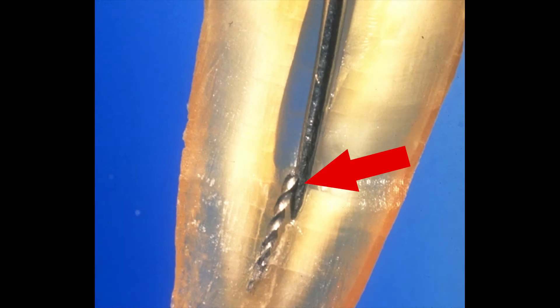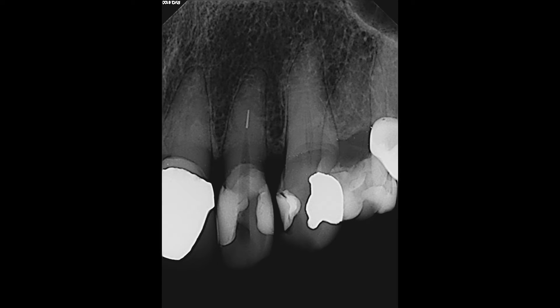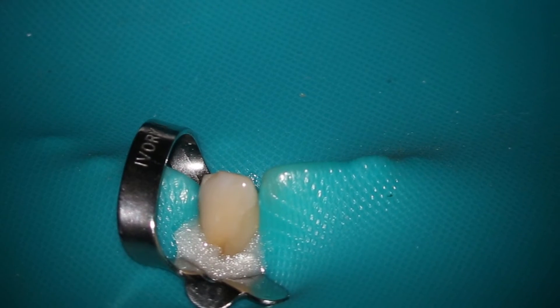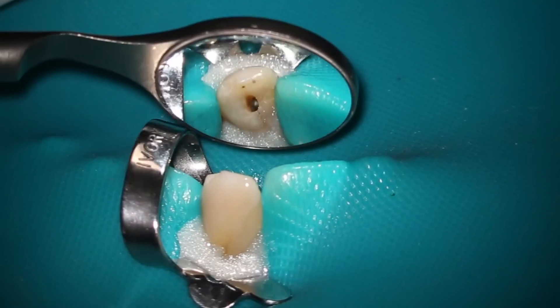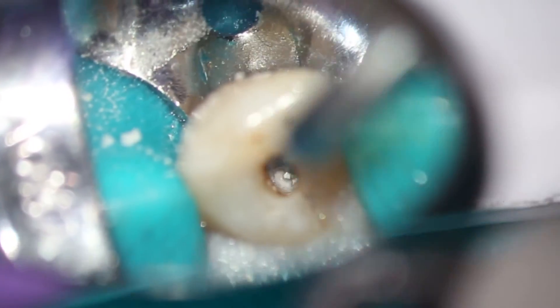Here you can see the SP2 vibrating along the side of the instrument. Here's a separated instrument case, so the first thing we're going to do is get visualization of the instrument. Here you can see we've used the Gates, gone down to the instrument — now we can see it clearly.